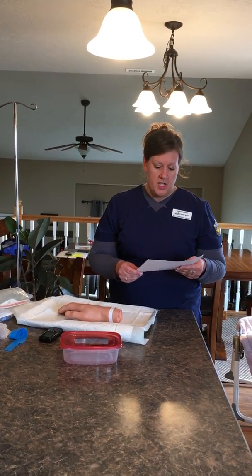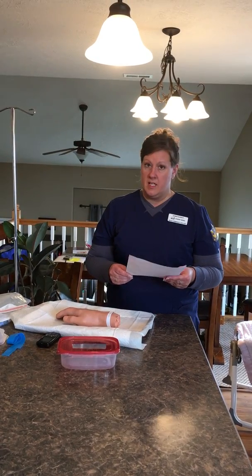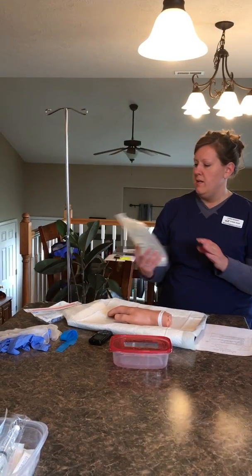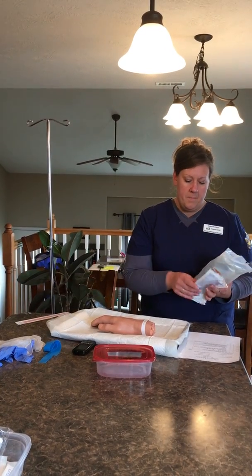First of all, we're going to initiate the IV of 0.9% normal saline at 1,000 milliliters infused over 6 hours. We're going to calculate the drop rate.